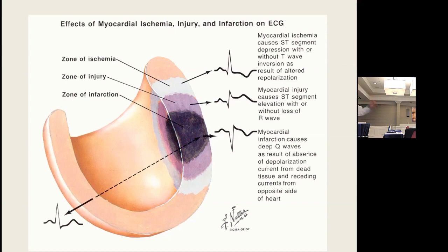But why the Q wave? Well, look carefully. I'm over here looking through. I don't see anything here, but on the other side of the heart, I see a depolarization from endocardium to epicardium. That force is always away from me. Hence the Q wave. The Q wave is not force generated by dead tissue. It's the contralateral wall that always has a depolarization vector from endocardium to epicardium. It may be minute. That's why the Q wave sometimes leaves little tiny blips, and sometimes they're huge. Just depends. But that's the genesis of a Q wave.